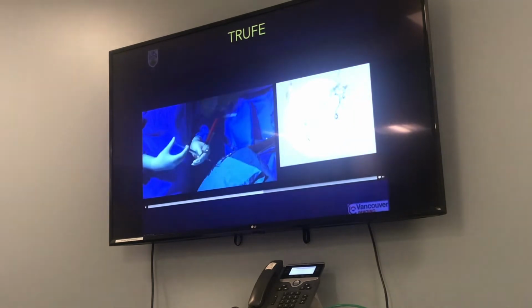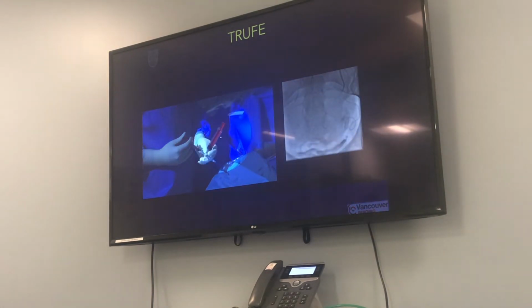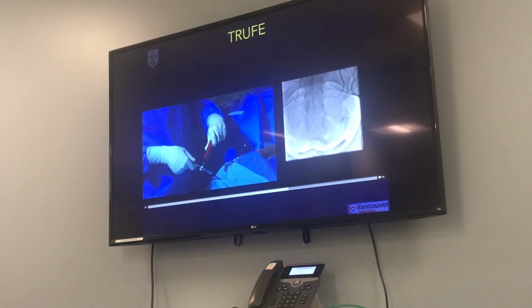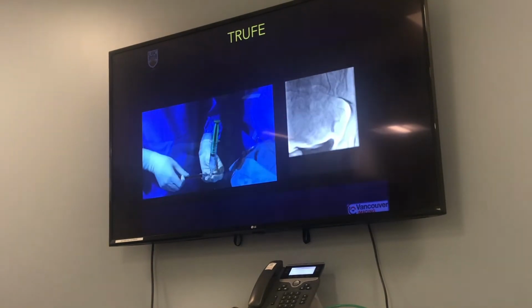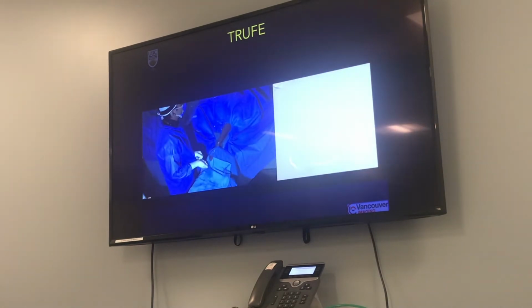And what we're doing is we're injecting the particles. You can see that red syringe on the end there. This red syringe is 500 to 700, and then I'm injecting them through a smaller syringe so I have much more control when I'm injecting. And then essentially what we do is we keep on injecting. You see now I've changed over to a green syringe. That's the bigger particle. And then at the end, when we inject, that's what we want to see.